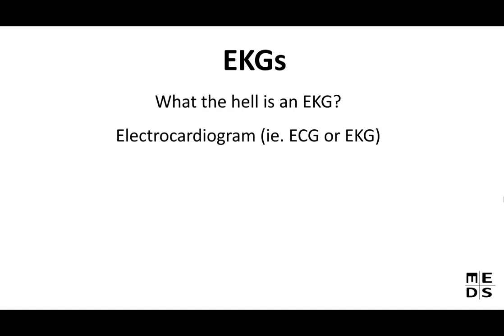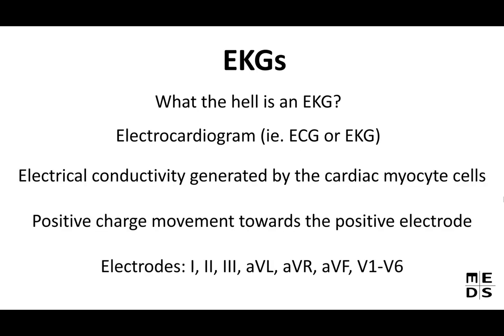Okay, so with EKGs, what the hell is an EKG? Essentially it's called an electrocardiogram. This could be either ECG or EKG. It's a machine that gets hooked up with electrodes to your body. No, it does not shock you. What it actually does is look at the electrical conductivity generated by the cardiac myocyte cells. And on the next slide, I'll show this more in depth.